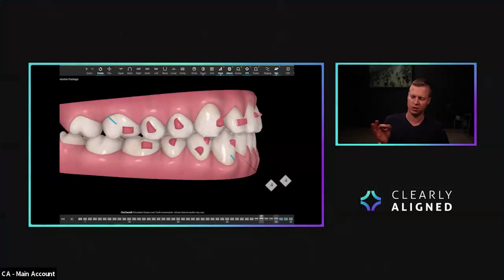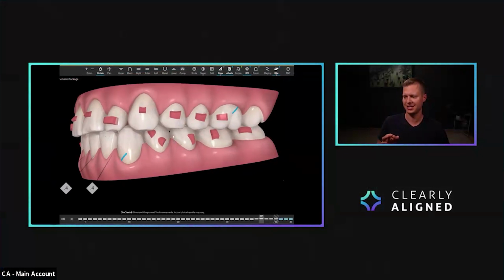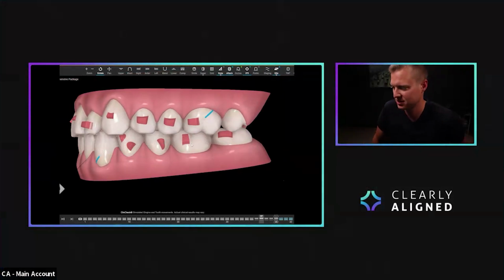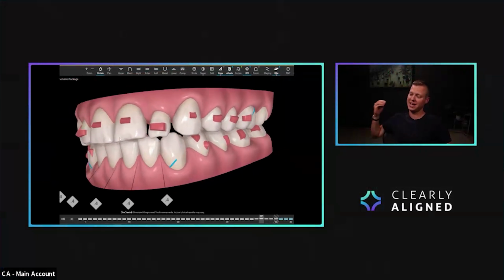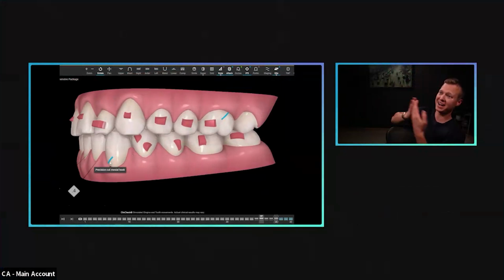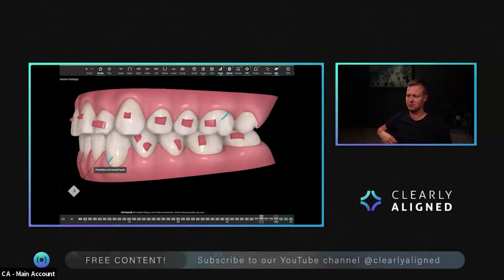It's a very minuscule amount, but when you're doing enough IPR, especially if we're getting distal of the canines and distal of the first premolar, then even doing IPR between these teeth, the molars will drift forward a little bit into that space. And so utilizing class 3 elastics whenever you're doing anterior or premolar IPR will help pull back those anterior teeth into the IPR spaces.